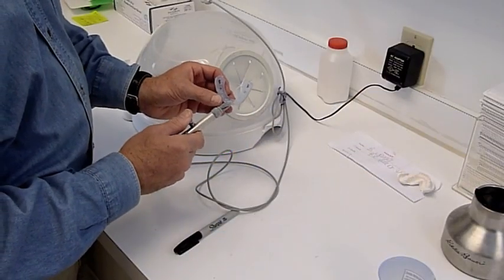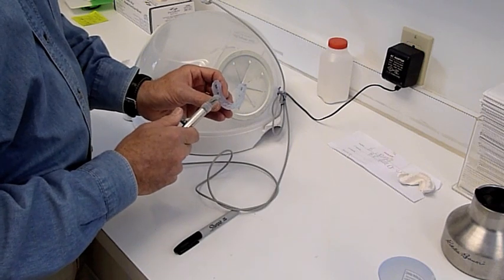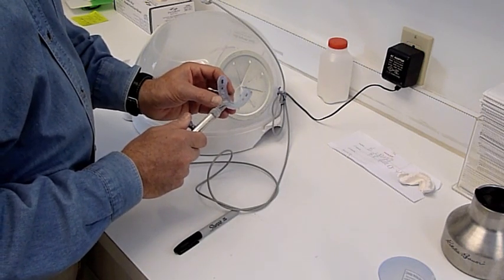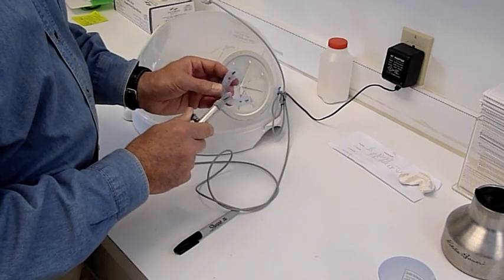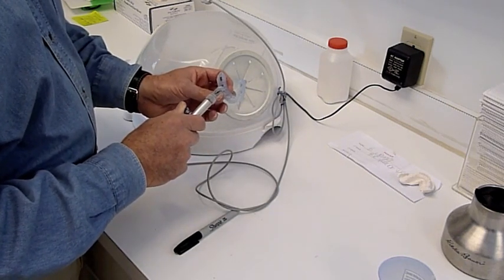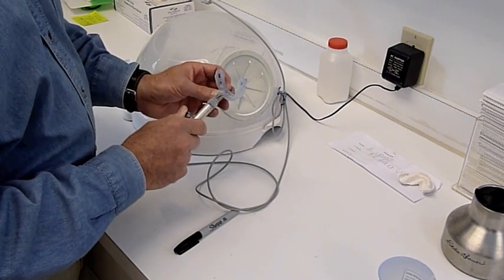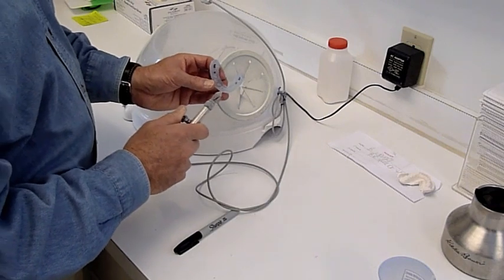I'm going to use our Danville air abrasion unit to remove the surface layer on the customized base on each one of the brackets. The metal brackets are a little bit more forgiving. You should be careful that we're only removing a small amount of material on the ceramic brackets because the bracket base has been prepared.